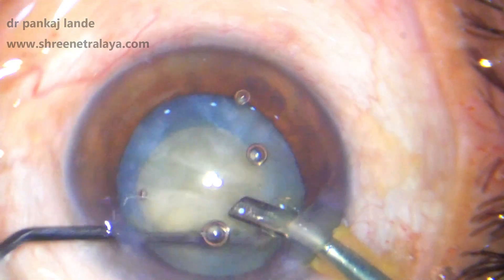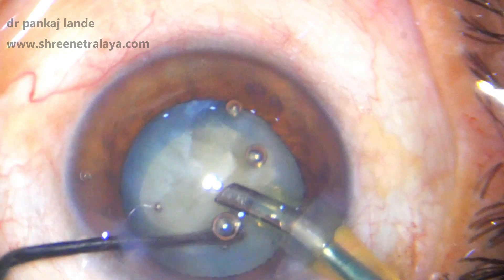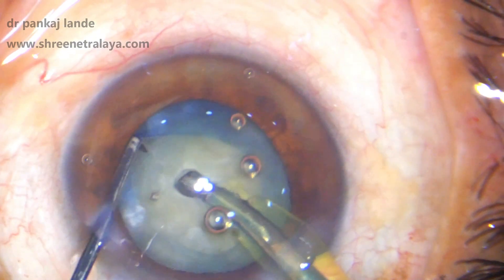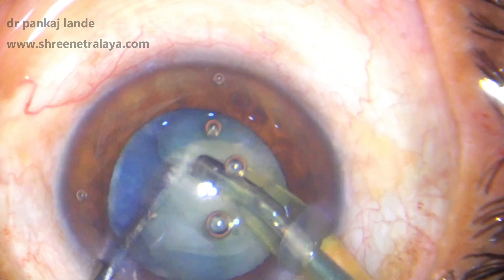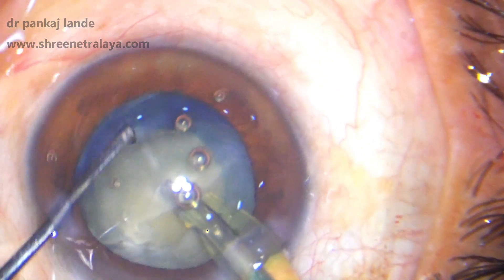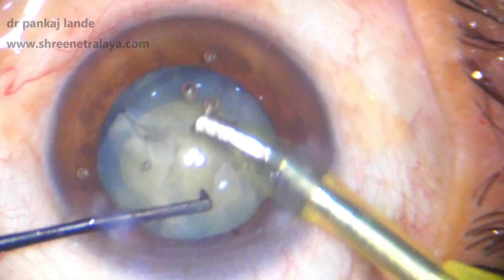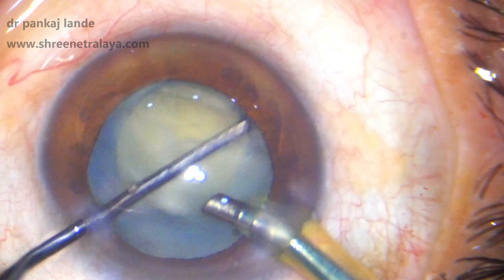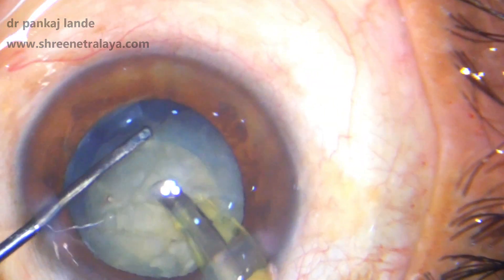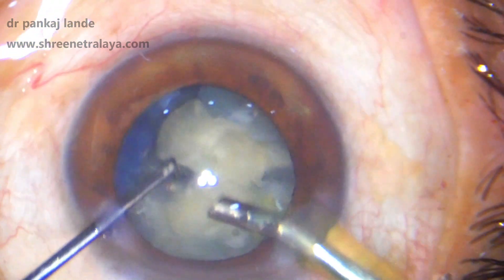With the phaco pedal in position 2, that is IA mode, cortex is debulked from the bag — this gives more room for maneuvers. The phaco tip is then buried 60 to 70 percent depth of nucleus, and the nucleus is tilted and chopped with the help of the chopper. The mantra is easy to remember: hold, tilt, and chop. Once you have the first chop done, you can rotate the nucleus 180 degrees and complete the chop in the other direction.